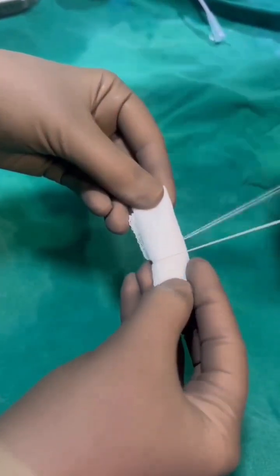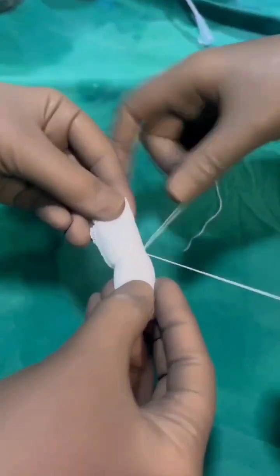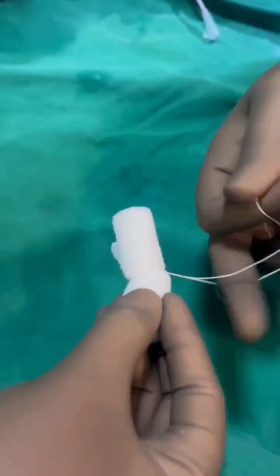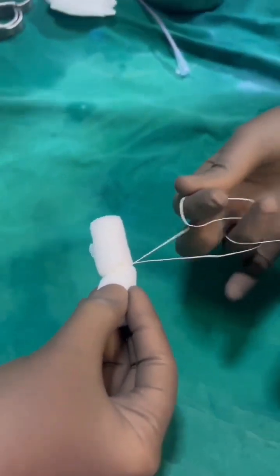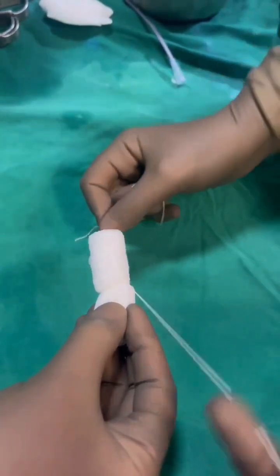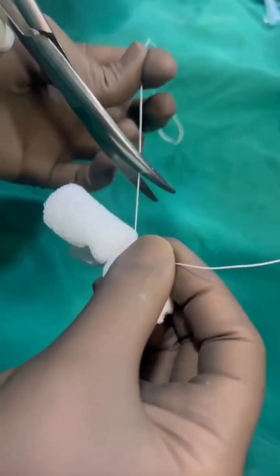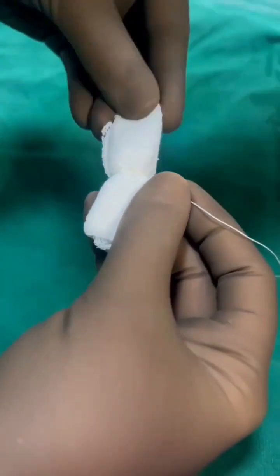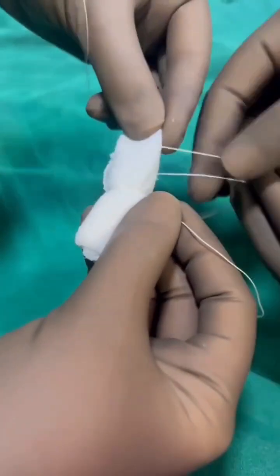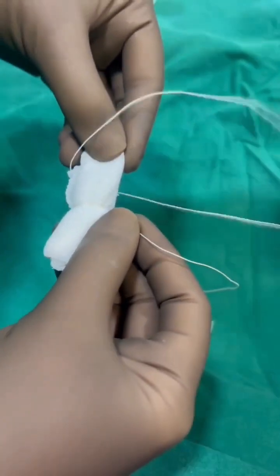The three threads: one is in the center — it's a normal knot that we tie. We secure it nicely and keep one end of the thread longer, then cut one of the threads. Again we take two more threads and tie on the sides, so three threads are tied on this rotated bolster-shaped gauze piece.